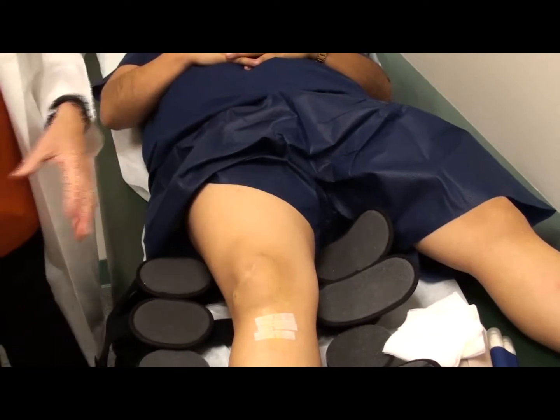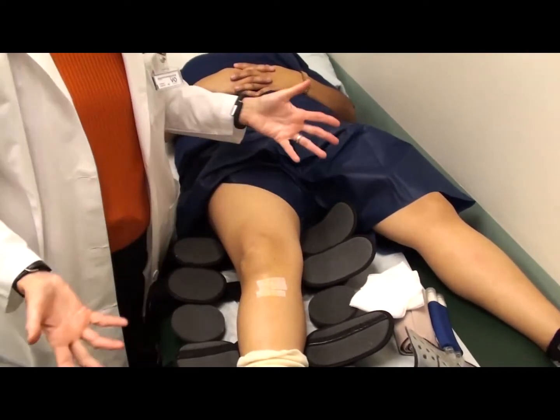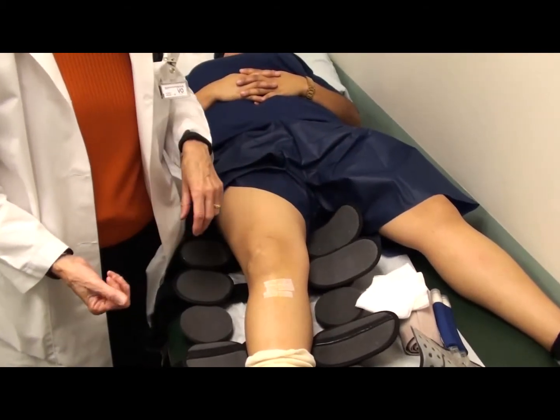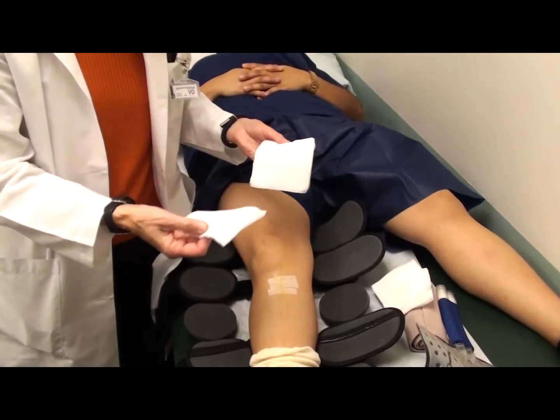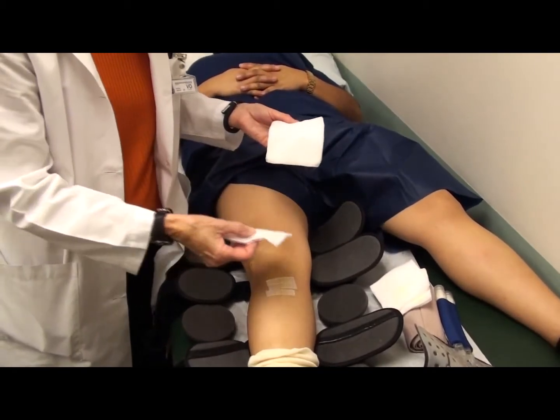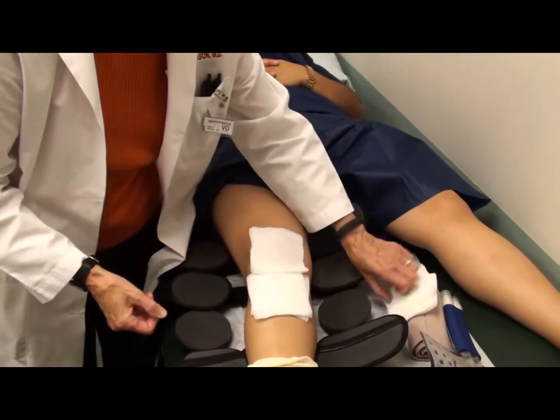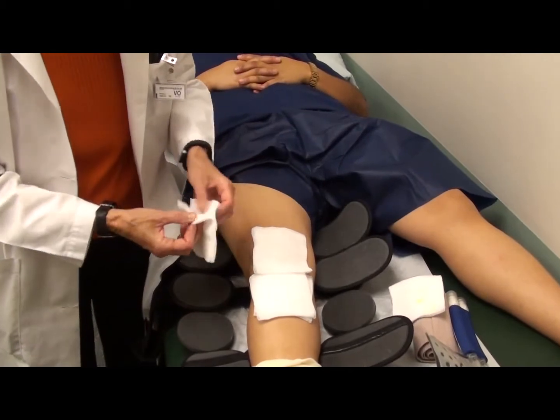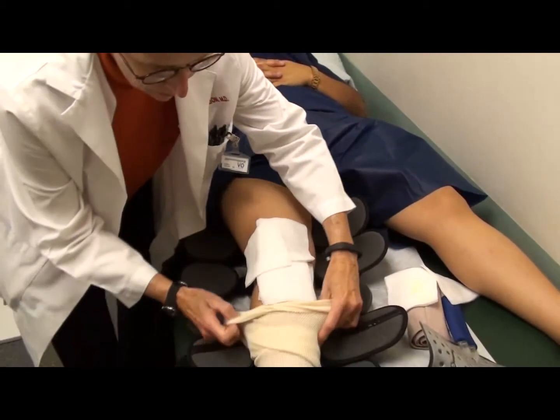So now you've got your dressing changed. So what do you do now? Well, you want to rebuild your dressing. On the incisions here, you can put a small Band-Aid, or if you have some clean 4x4 gauzes, and I recommend that you get some before you do the dressing change, you can just put 1 or 2 over the incisions so the brace doesn't rub on it. You can just lay these back on. Of course, these will be clean for the new one. And then you pull the stocking back up.